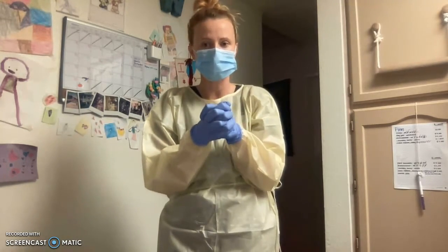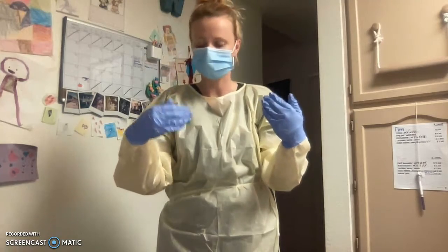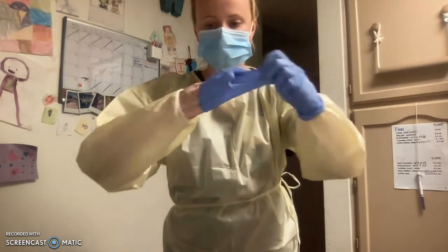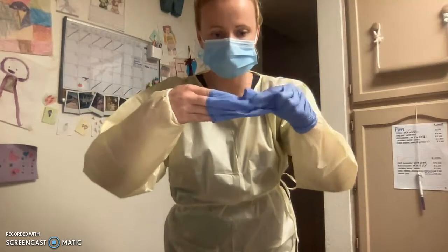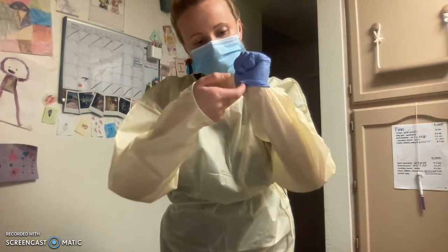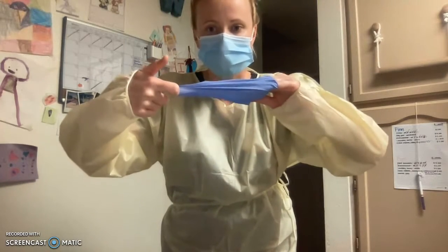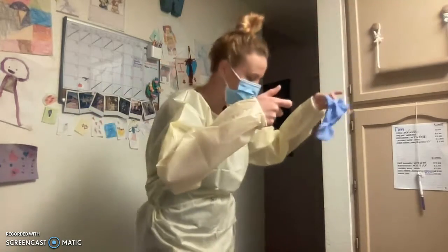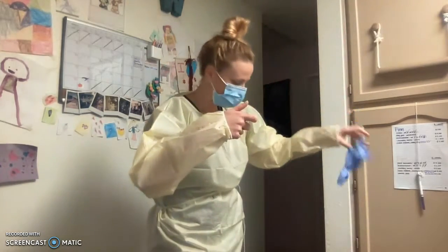Before exiting the room, I will remove the PPE. Gloves first. Grab the cuff of the glove, pull it down, and bring it inside out — just so that nothing touches my hands. Disposing of it in the biohazard waste trash.